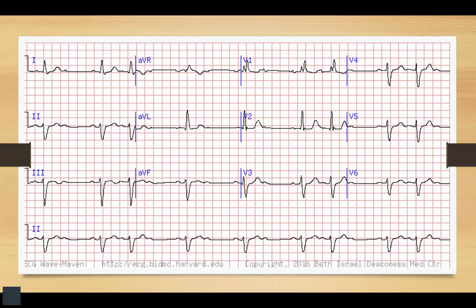And then we have a P wave. It looks like a change in pattern. Yeah, exactly. It goes from a 3 to 1 to a 2 to 1. Exactly. So it's really changing as well.